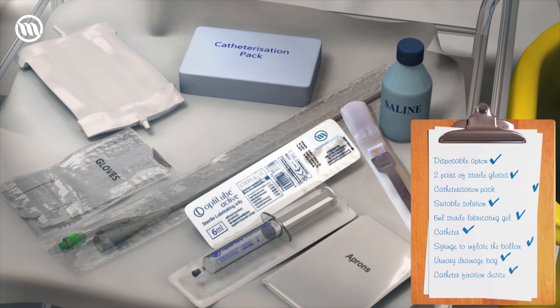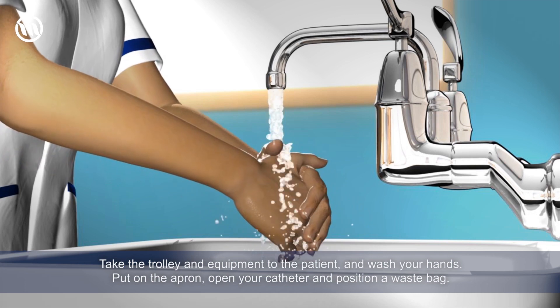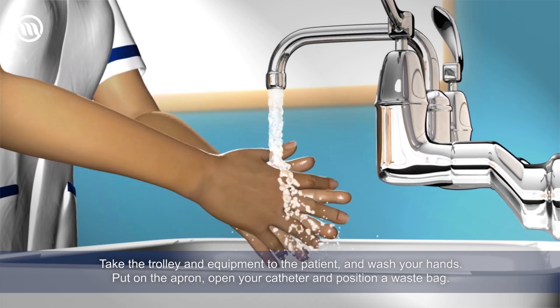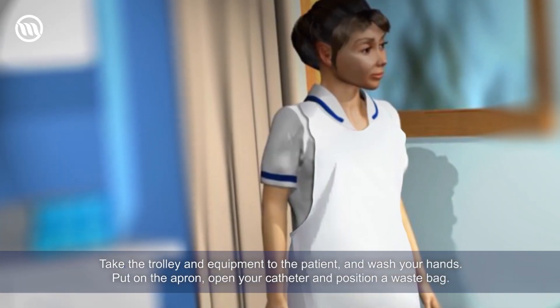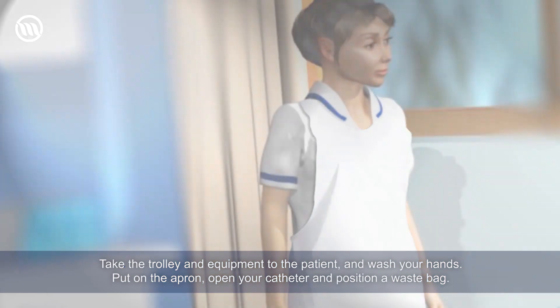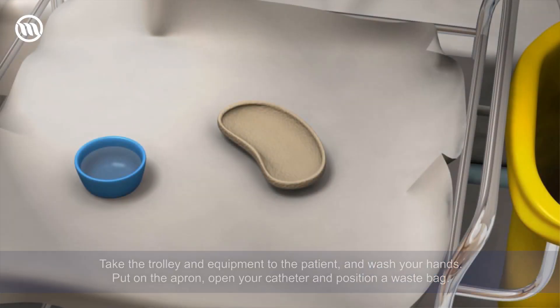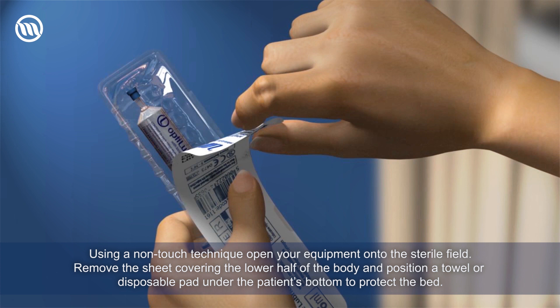Take the trolley and equipment to the patient and wash your hands. Put on the apron, open your catheter, and position a waste bag. Using a non-touch technique, open your equipment onto the sterile field.